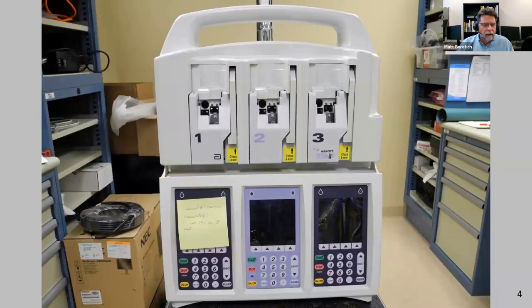I want to tell you just a couple of slides about two different cases with this same three-channel infusion pump. And what I wanted you to look at is across the center of that device, there's kind of a shelf there. And there are a couple of problems with that: it tends to collect fluids, the infusion medication, for example, and because of its mechanical design tends to break.